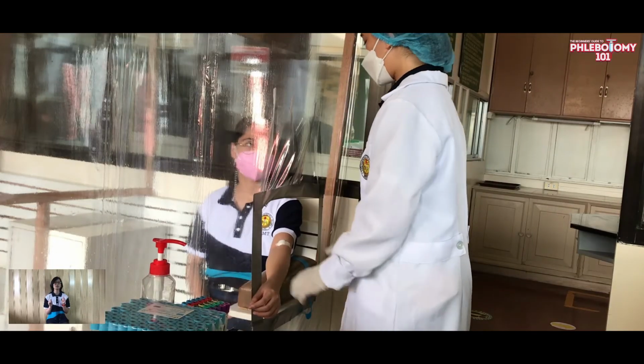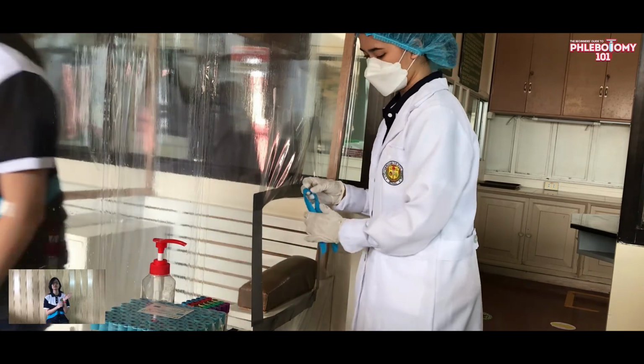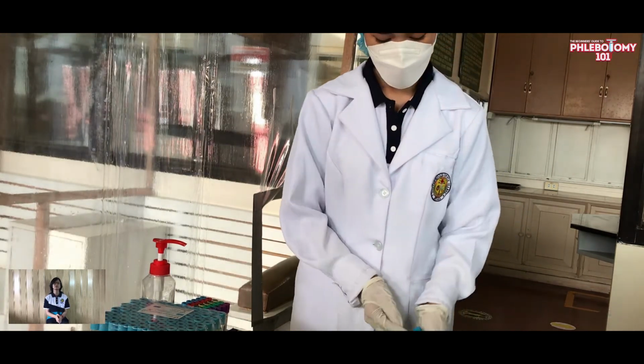Step 14. Dispose of the contaminated materials. Siguraduhin sa tamang container ilalagay ang mga materials. Halimbawa, sa sharps container itatapon ang ating used needle. And after the venipuncture procedure, it is important to thank the patient. Remove your gloves and resanitize your hands afterwards.